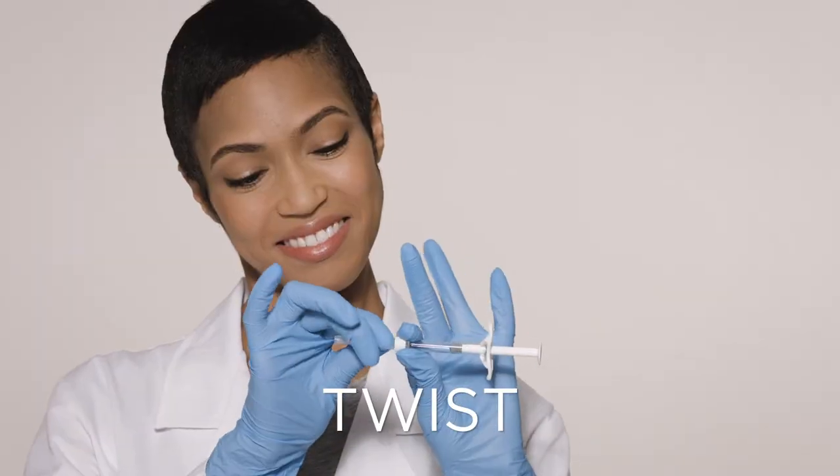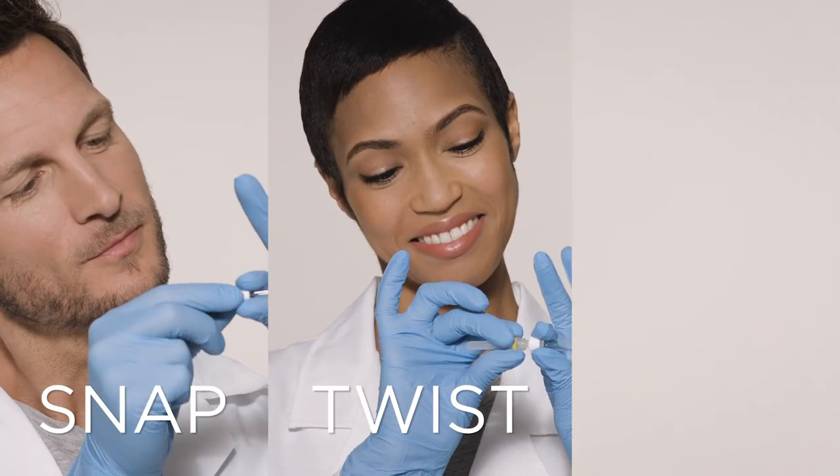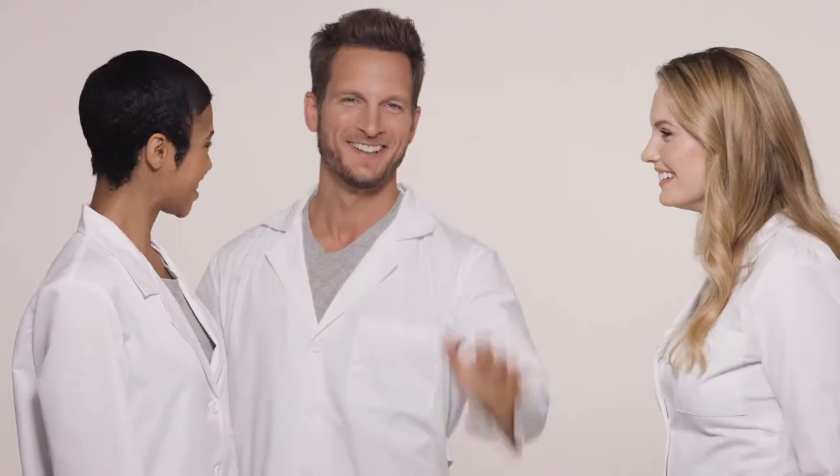Snap, twist, pull. Great work, team — I think your mission has been accomplished. Syringe Squad signing off. Thank you.